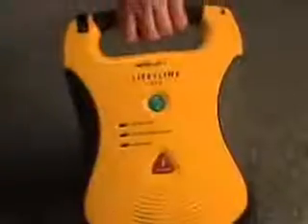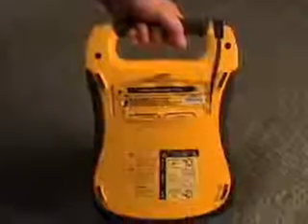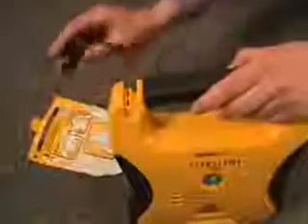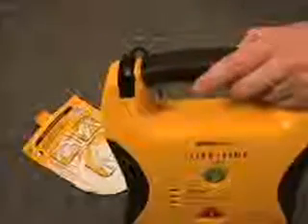The Lifeline AED should have been stored with the pads already pre-connected and in the pad storage pouch on the back of the unit. Remove the pad package by pulling on the tab on the pouch. If the pads are not already pre-connected to the unit, connect them by inserting the pad connector into the top left corner of the AED. Remove the pads from the package by tearing along the dotted line. Follow the instructions printed on the package.